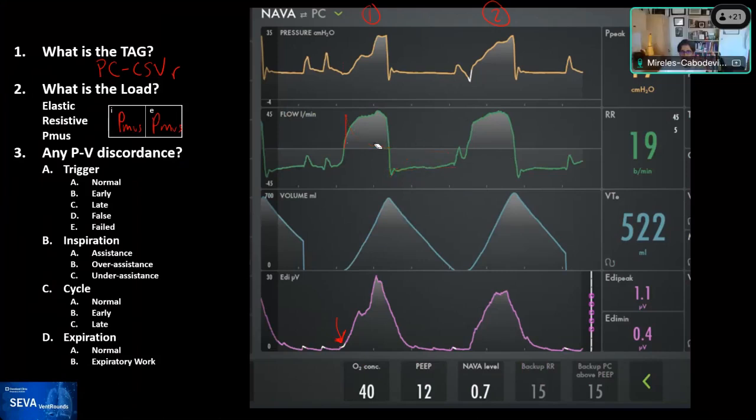Yeah, and this is one of the rules of good high quality respiratory care: when you have one of these patients and they have a discordance, you use not only the sense of sight when looking at the ventilator screen, but also looking at the patient, putting your hand on the chest or the abdomen, and listening to the ventilator. There's a lot that comes from just listening to the air go in and looking at the patient and how that interaction is occurring. And so that can help a fair amount when going through this.